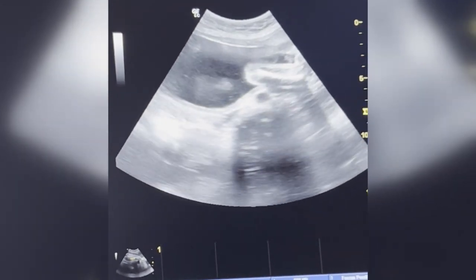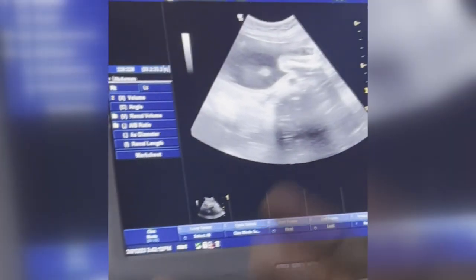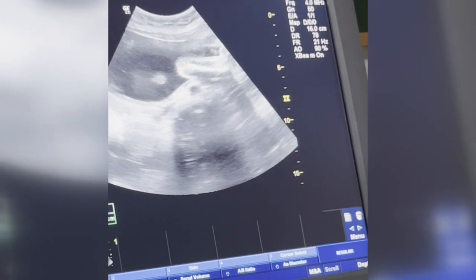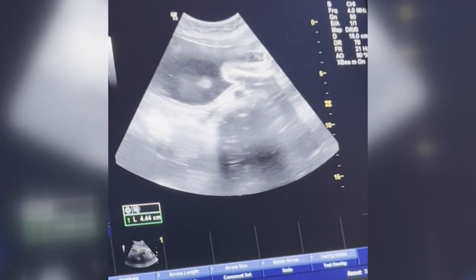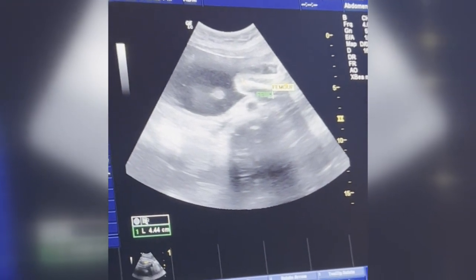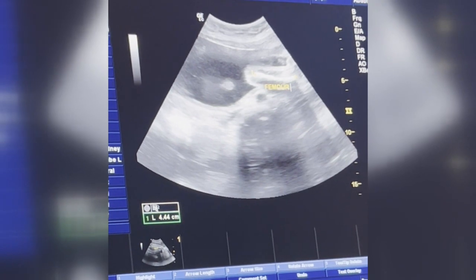Femur is displayed. You freeze it. Now I should take the measurement. It is the femur. Okay. I am writing femur. That is femur. Okay.